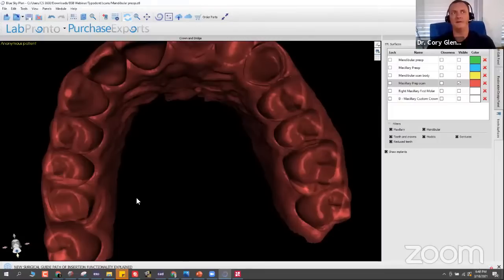Now, if you do that, you've obviously got to be aware of the opposing tooth. And so later in the design phase, there's actually a color intensity map. You didn't see it on that one just because it didn't have an opposing tooth, but you would see that color intensity and you could know if it's high or when it's just right, and you could adjust accordingly. If you still don't have adequate thickness after doing that, well, that's a prep problem, right? You just didn't reduce the tooth enough. So that's kind of out of the software's control at that point.